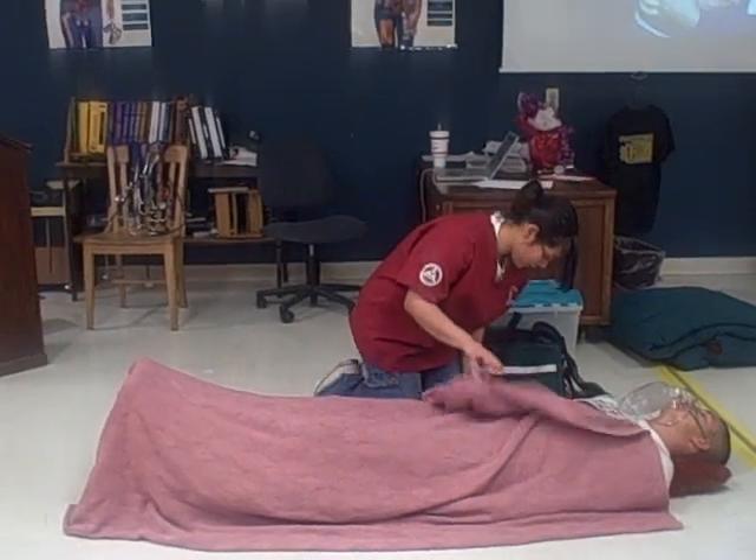I will cover the patient to prevent body heat loss. All right, you may put everything away at your station. Thank you very much.